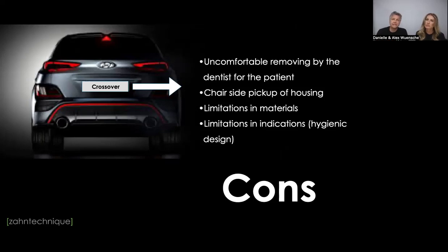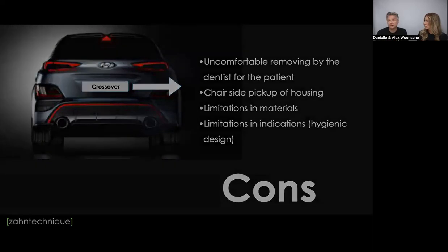Treatment planning is key here, but not every overdenture or Locator Overdenture can be transitioned to a fixed case. That's very important. Talk to your laboratory, provide us photos and videos of the patient, before we promise something that maybe cannot be done.